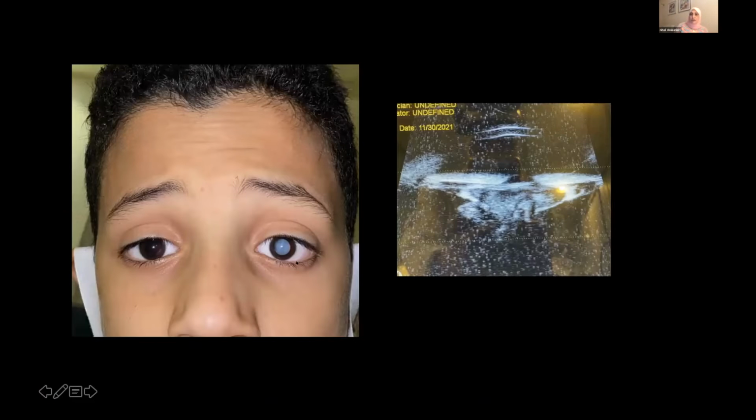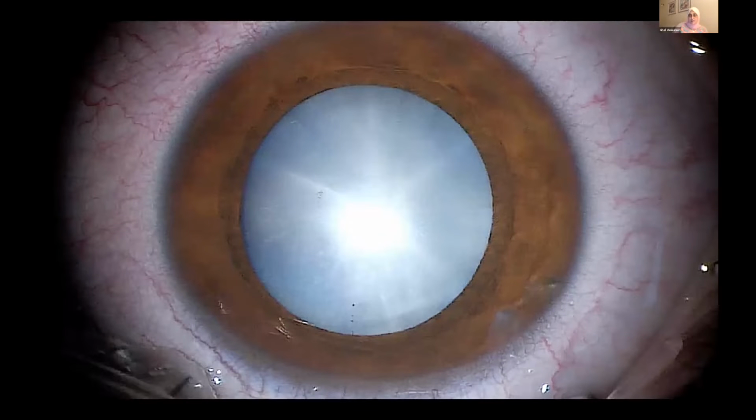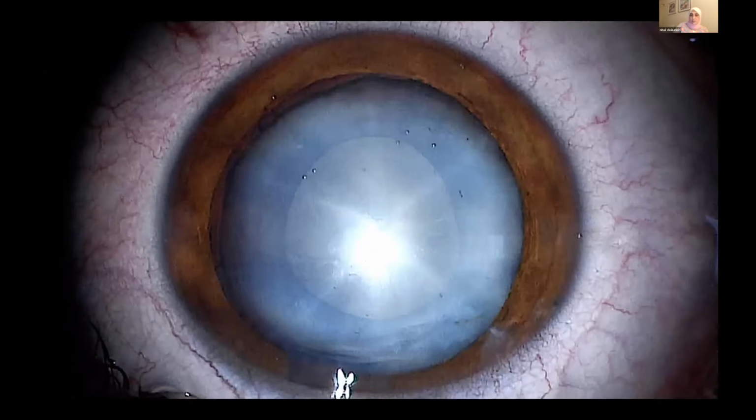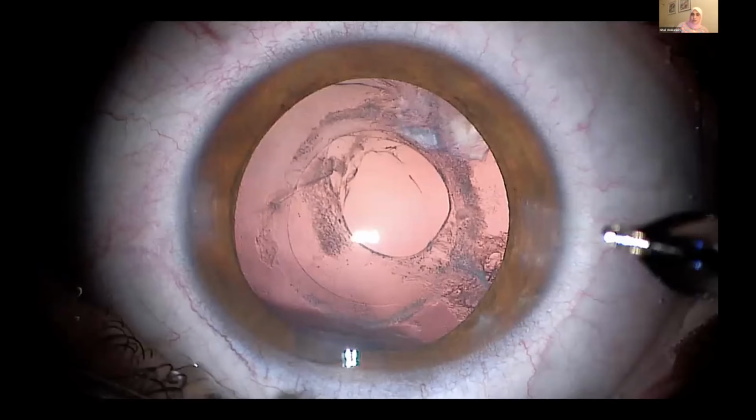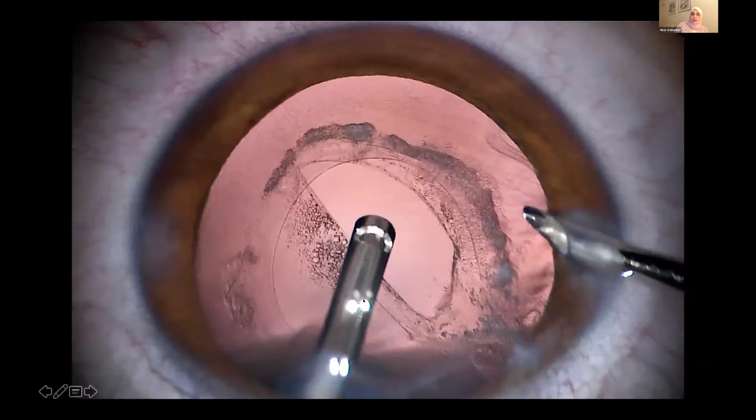But in cases of a large defect, as in this case, it is diagnosed by a UBM. How to deal in large defects? The key of success in these cases is the anterior capsular rexis, which should be exactly 5 millimeter, and it should be exactly central. After irrigation aspiration, first, before deciding what to do, we have to go for vitrectomy to clear the edge of the tear from vitreous. And then we decide.